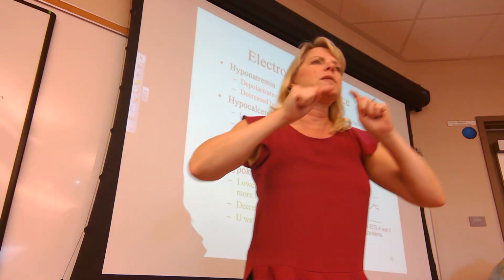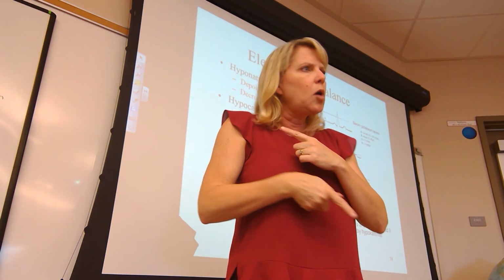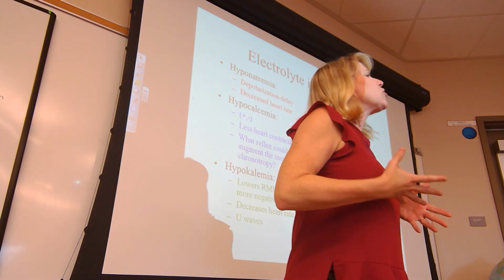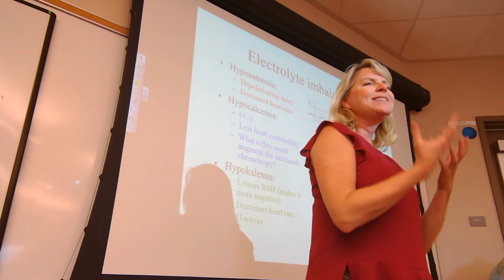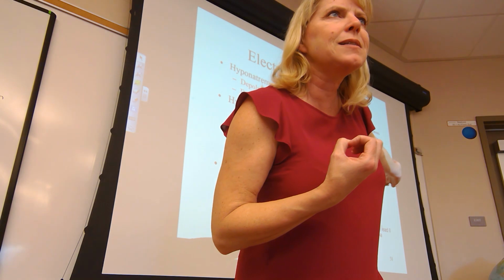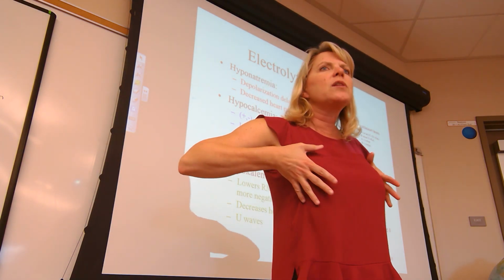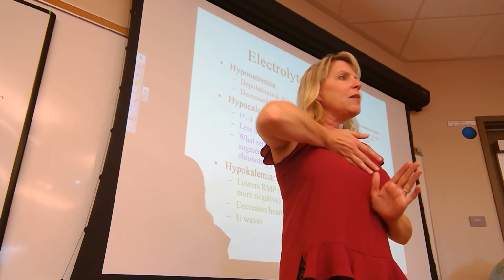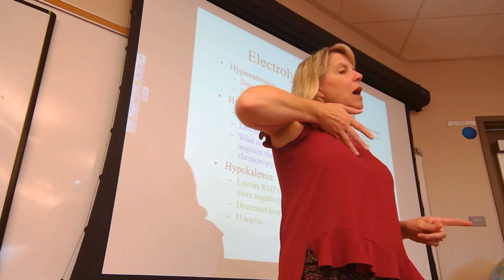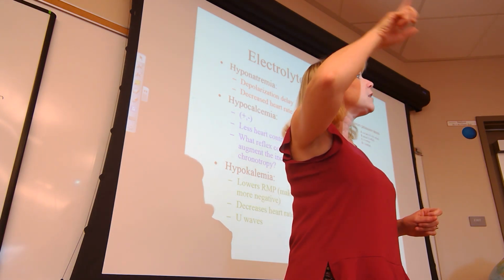Ventricular depolarization had three different vectors, Q, R, S. When ventricular repolarization is not as fast as it should be because of electrolyte imbalances like hypokalemia, then we get separation of the ventricular wall versus the IV septum, and now we get ventricular vector and IV septum vector. And that's why we see the T and then the U.